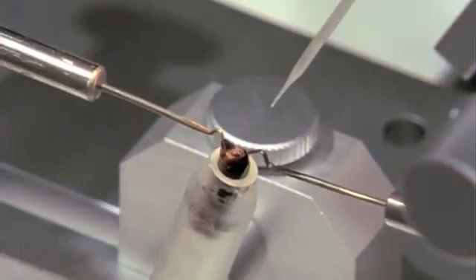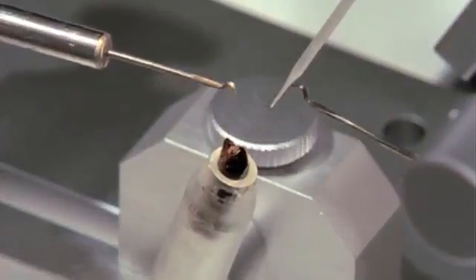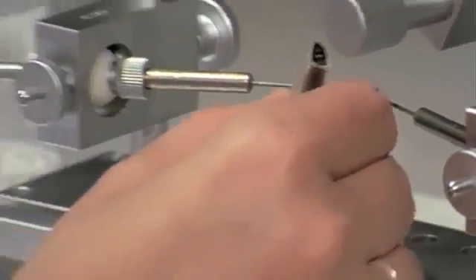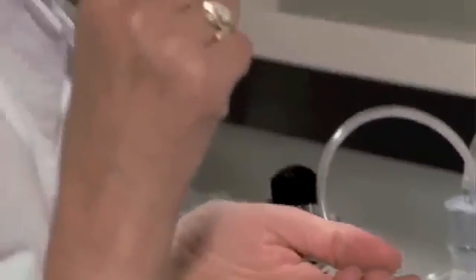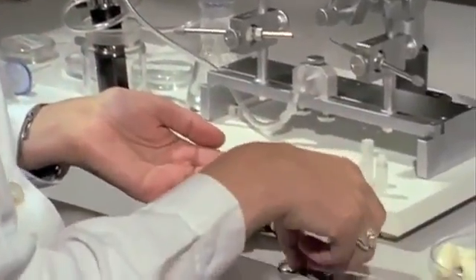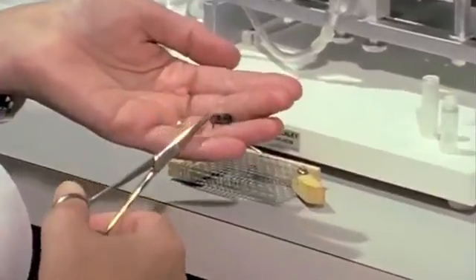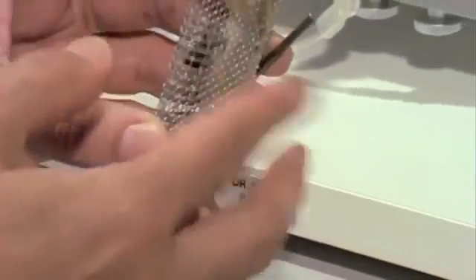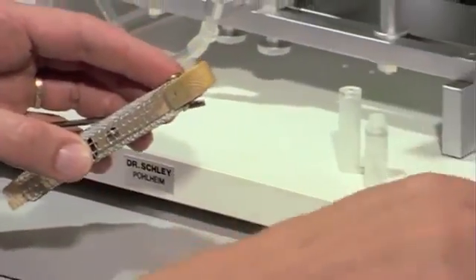The syringe and the hooks are removed. The still narcotized queen is released from the holder. Clipping one wing prevents her swarming later on, but it is nonetheless essential to cover the entrance of the mating cage with an excluder as well.